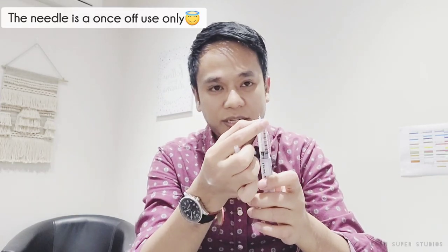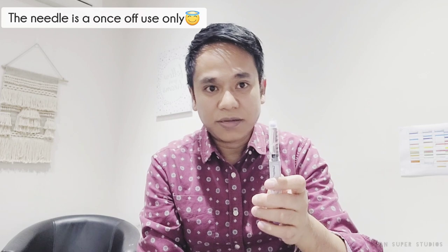Remember not to throw the outer white cap away — you need it to safely remove the needle. The needle is a once-off use; you don't use it twice because there is a risk of infection. Put the cap back on and unscrew the needle — this protects your finger from accidental pricking. There you go: no more needle, and it's safe.